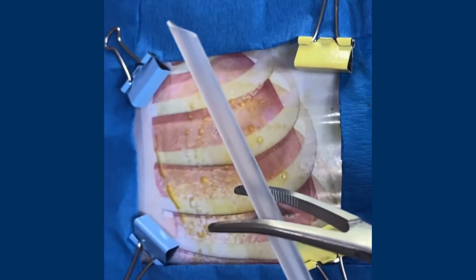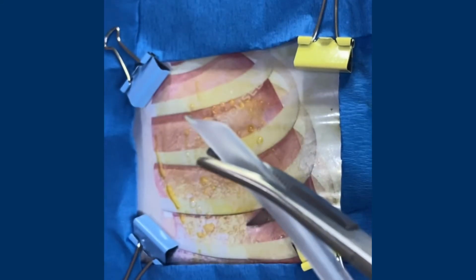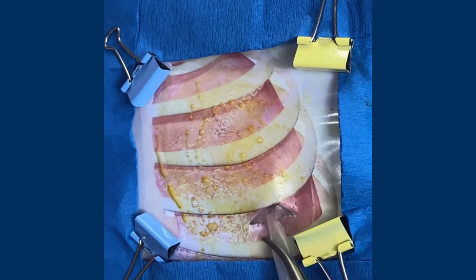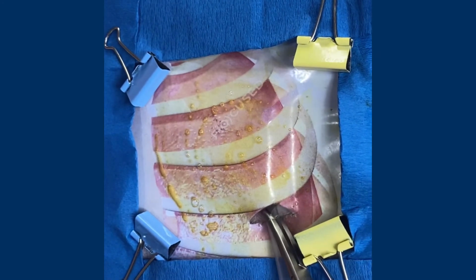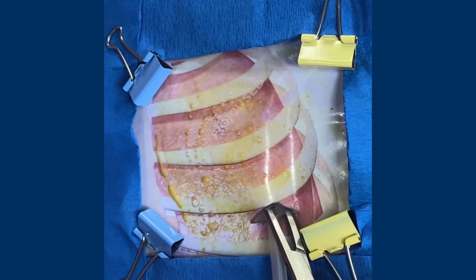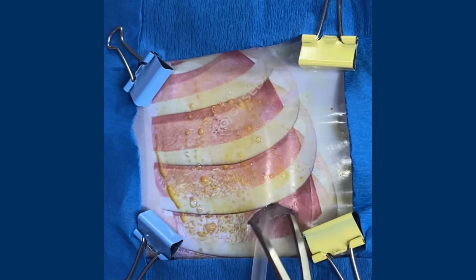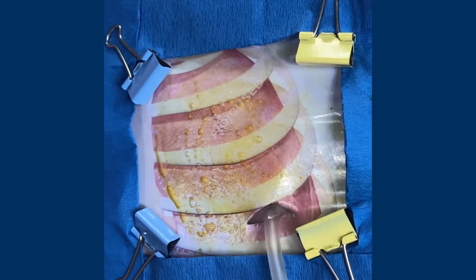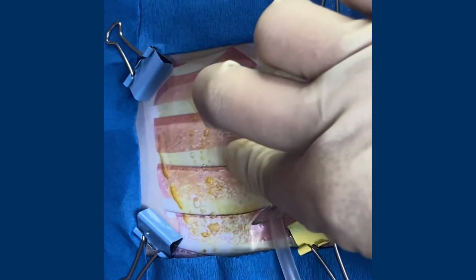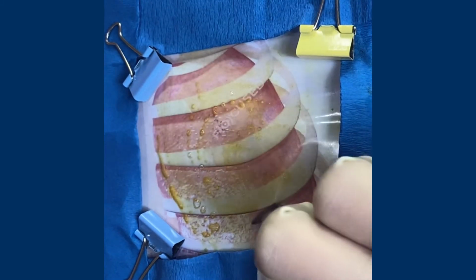Grasp the tip of the tube with a curved Kelly clamp wherein the long axis of the tube is parallel to the long axis of the clamp. Make sure to clamp the distal end of the tube if hemothorax is suspected. Insert the tube to the chest with a large Kelly clamp as a guide. Remove the clamp when the tube has reached the desired position in the chest. Palpate superiorly and inferiorly to ensure that the tube has entered the chest.